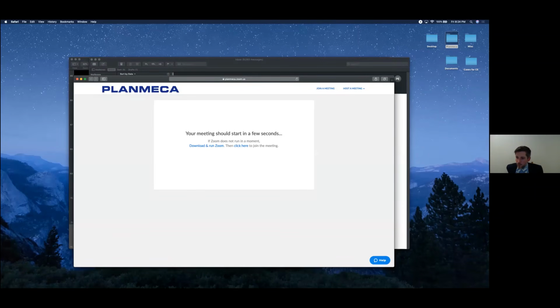Do I have a report sample or outline? Yes, so I write my reports by the anatomic structure. Just like in that flow chart that I showed you earlier, I have a paragraph about the dentition. After the dentition, I'll comment on the airway.